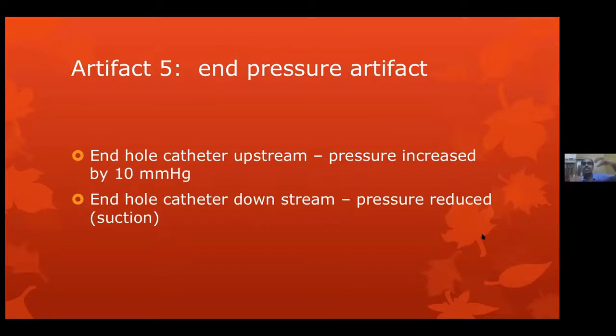Doppler effect is, if I emit a sound at a particular frequency, the sound goes forward, hits a resistance, and the resistance reflects this sound back towards me.